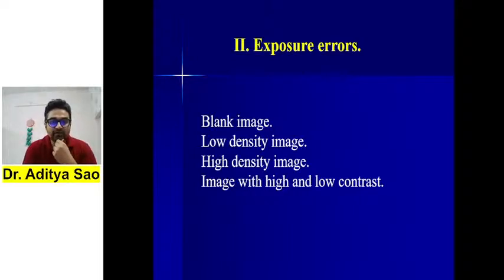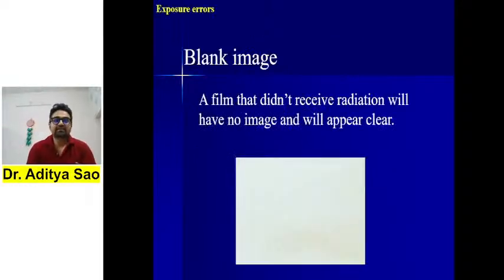Now we are going to discuss the exposure errors, like what are the problems that can occur due to exposure, whether it is low kVp, high kVp, low mA, high mA, or exposure time parameters. Okay, so in exposure errors we are going to discuss blank image, low density image, high density image, and image with high and low contrast. So the first is a blank image.